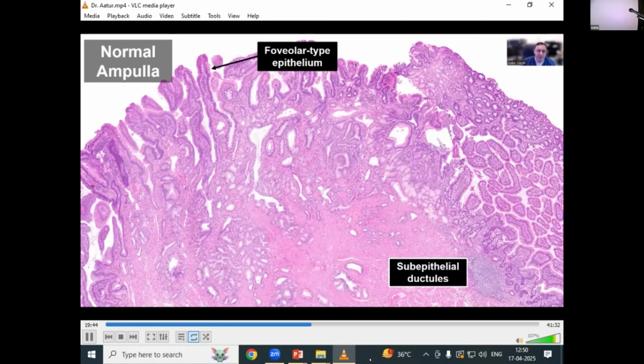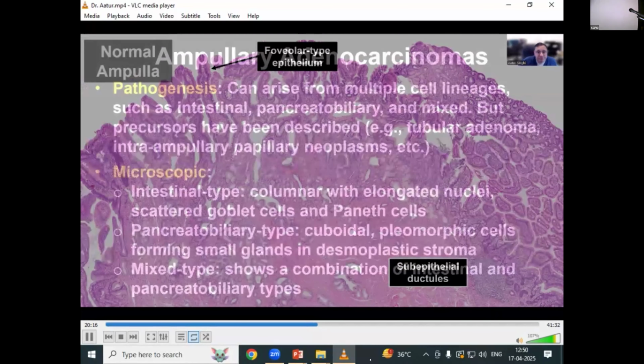And I can't tell you how many times I've seen a consult where a patient had maybe a pancreatic ductal adenocarcinoma and a pathologist took another section of the ampulla, which they should, and they're concerned whether there was something pathologic occurring in the ampulla, whether it be dysplasia or even a potential malignancy. But it's important to understand that reactive processes do occur in the ampulla and can look highly atypical from an architectural perspective. So it's essential to not only evaluate the architecture, but really the cytologic features in parallel when it comes to the ampulla, especially when dealing with biopsies of the ampulla.